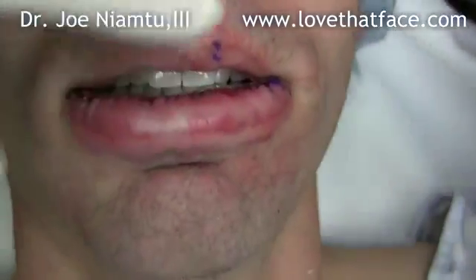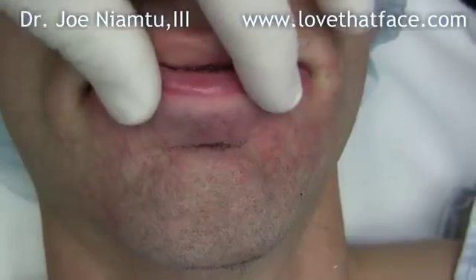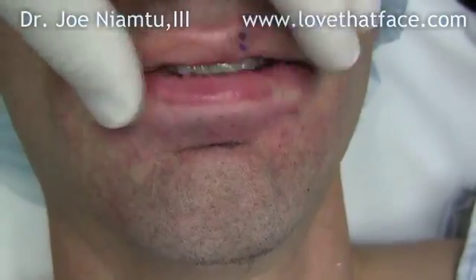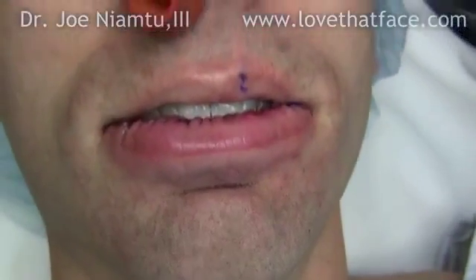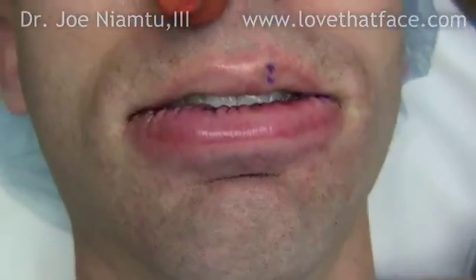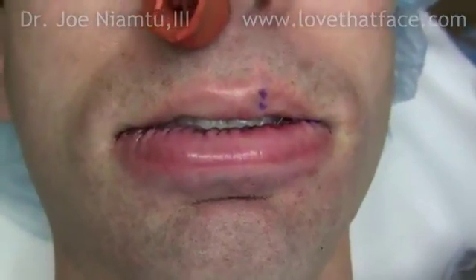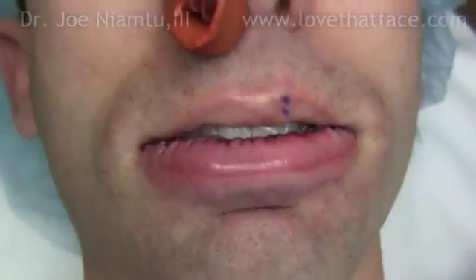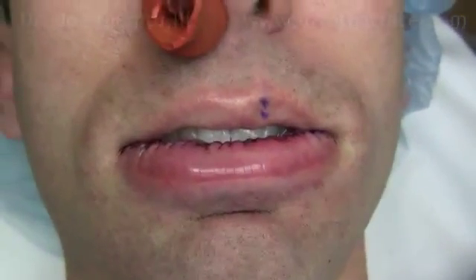Here is our final closure with the 6-0 silk. We'll probably leave that in for a week or a little bit longer. Right now you'll see the suture line, but when the edema goes down it'll be hidden. That's our lip reduction on a Caucasian patient. For more information about lip reduction or cosmetic facial surgery, see Dr. Nyamtu in Richmond, Virginia at lovethatface.com.